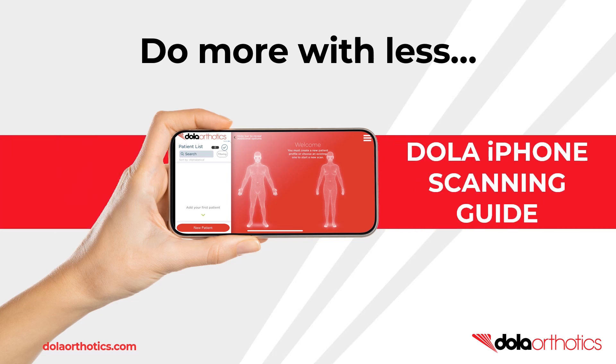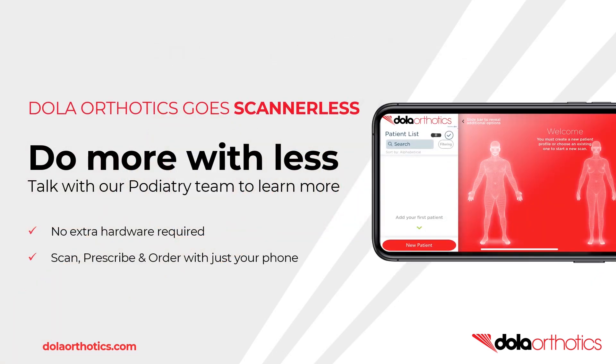Welcome to the Dollar iPhone scanning guide. This guide is designed to help health professionals take 3D foot scans using an iPhone for the ordering of foot orthotics. Learn to do more with less — scan, prescribe and order orthotics just with your iPhone.